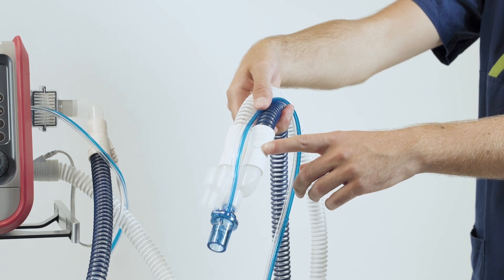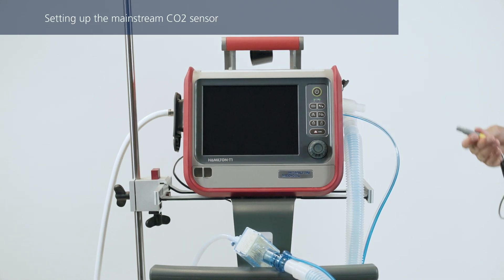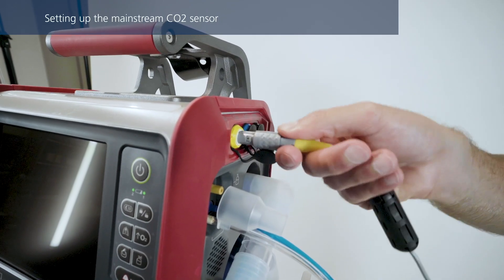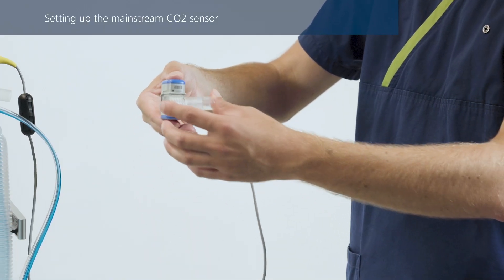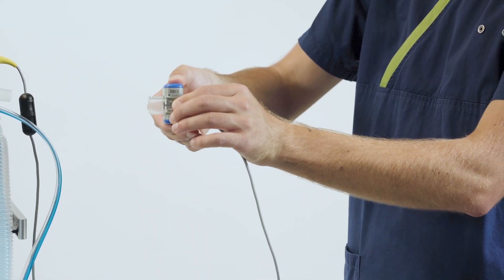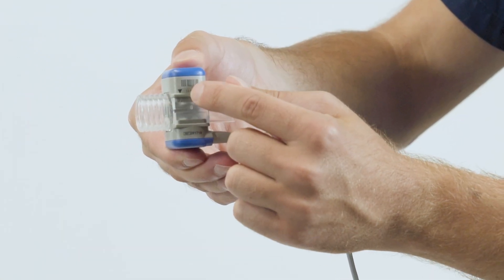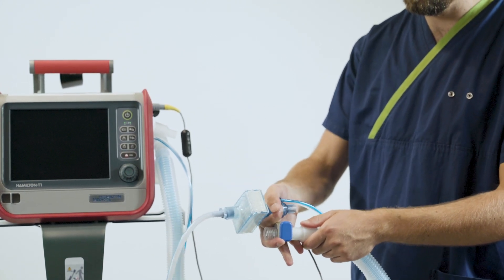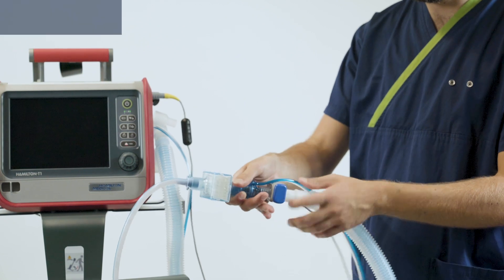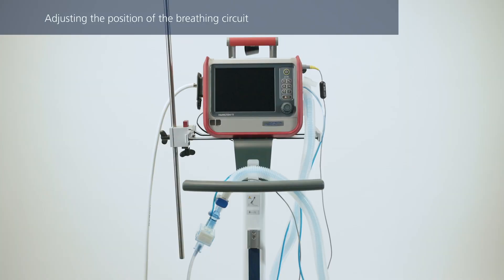Make sure you keep the inspiratory limb positioned correctly. If you are using a mainstream CO2 sensor, you can connect it now to the corresponding connection port. Slide the CO2 sensor onto the airway adapter, align the arrows on both components, and press them together until you hear a click. Then connect the sensor with the airway adapter to the breathing circuit before the flow sensor. Position the breathing circuit so that the tubes cannot be pushed, pulled, or kinked if the patient moves.